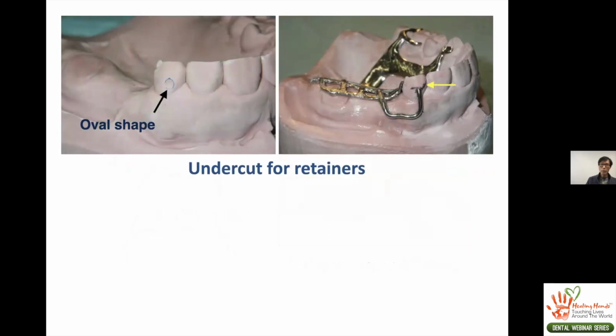This is one fashion in which I like to develop for an I-bar. If you look at the facial axial of that canine, you can see a kind of oval shaped dimple so that the tip of the I-bar can be tucked in. The very tip of the I-bar can match with the height of contour, but still, because of the depth of the dimple, a good portion of the terminal of the I-bar is tucked into the undercut, and there's good retention there.